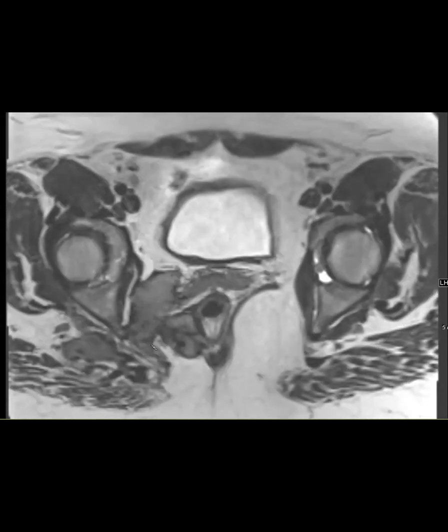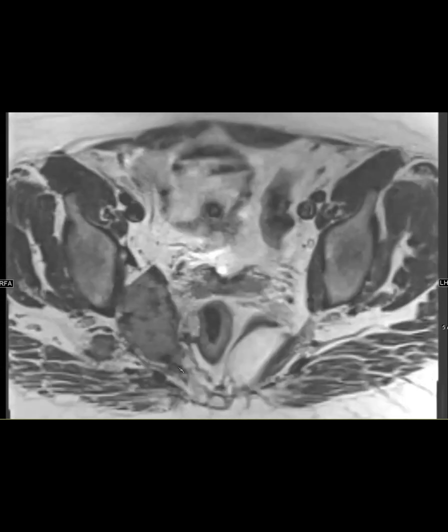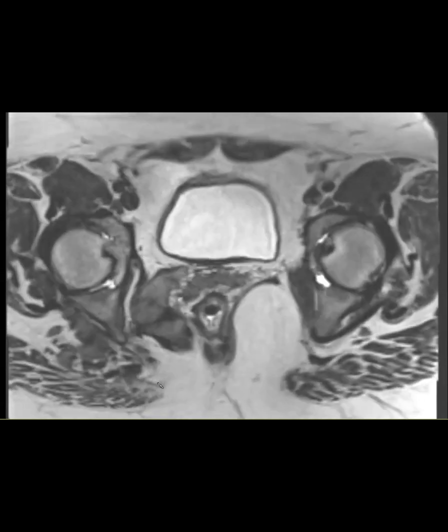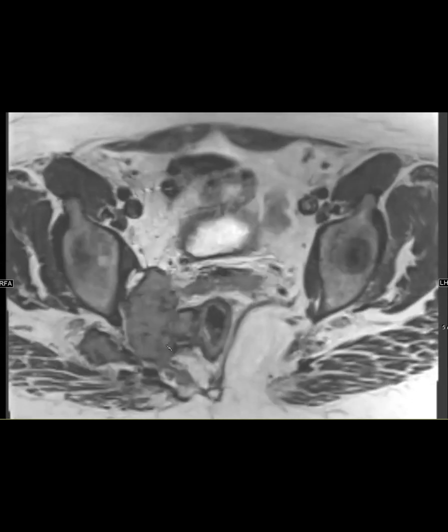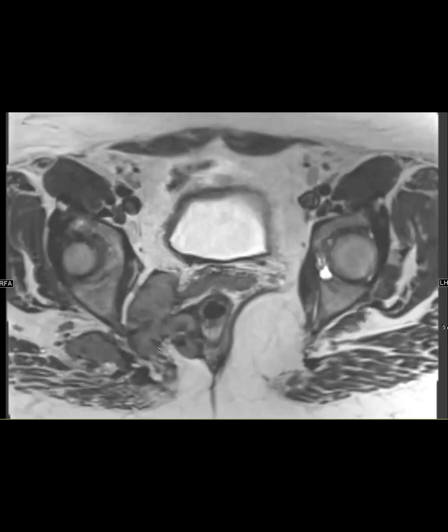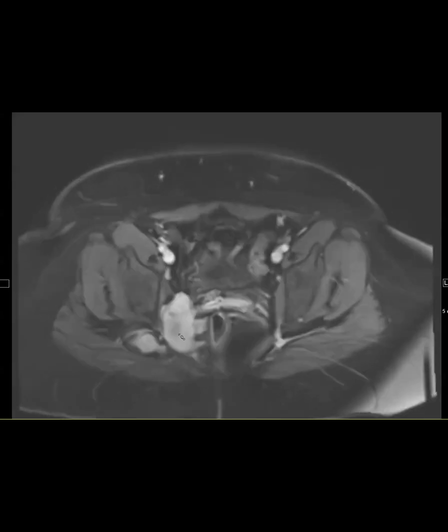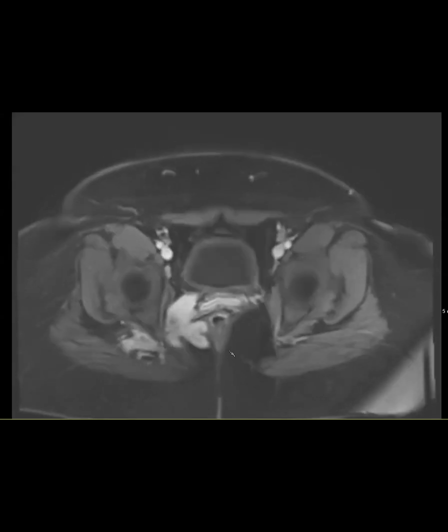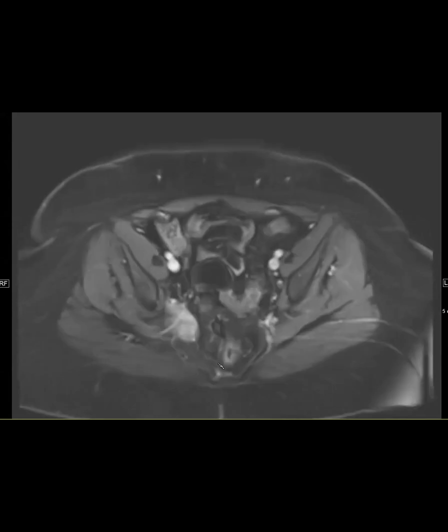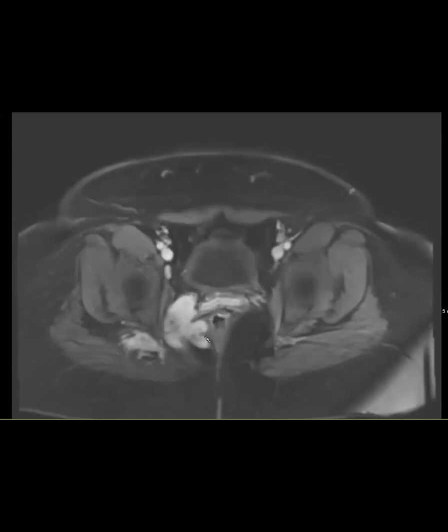So you can get these anywhere. Patients with Gardner syndrome, FAP tend to have them more commonly. And then they can be in these sometimes unusual locations. Just because they're fibrotic doesn't mean that they're T2 dark. In fact, they can be fairly T2 bright and have this kind of bland, dense enhancement. And they can grow in an infiltrative pattern as well. Due to symptoms, this one was actually ablated by one of our IR docs.